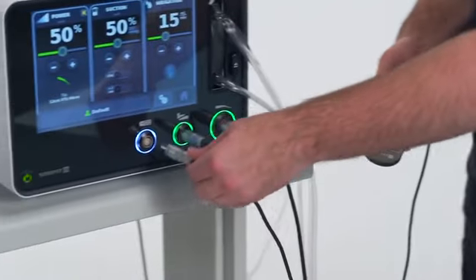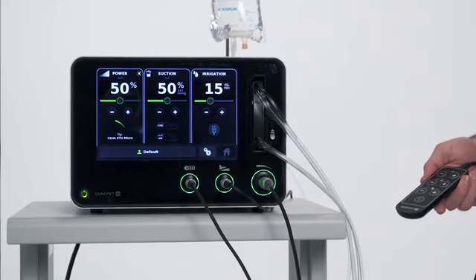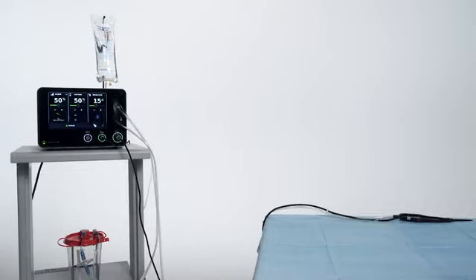The optional hand controller is not required to operate the Sonopet IQ system. To use, follow the steps within the IFU to properly set up the sterile drape with the hand controller.